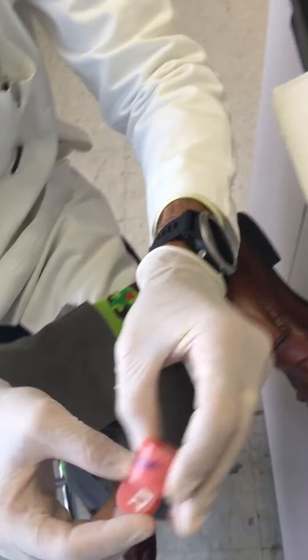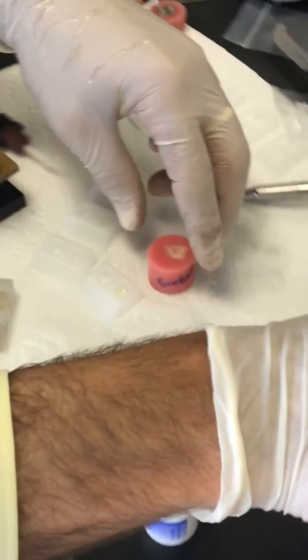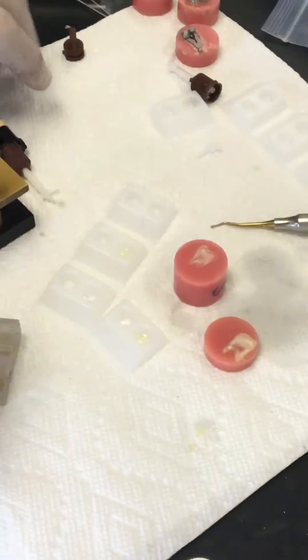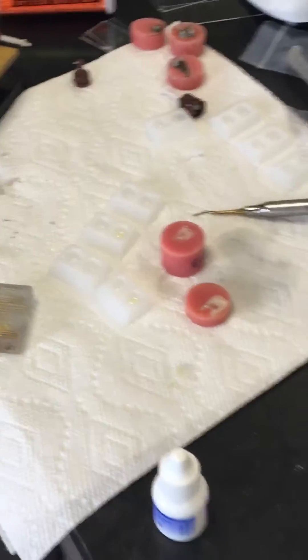I have two bond strength specimens right here — just regular teeth. We're going to bond to dentin. And I'm going to do this on both. Arthur here found out something really cool that I want to share with you.